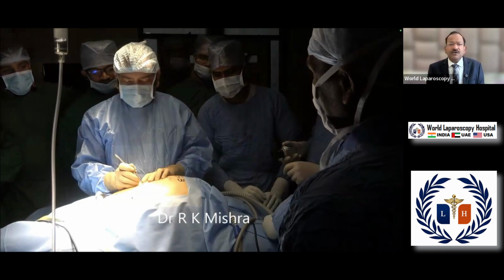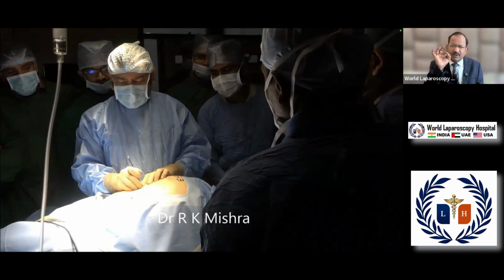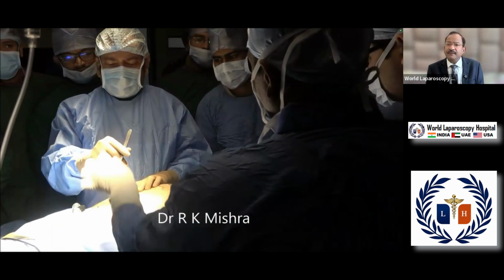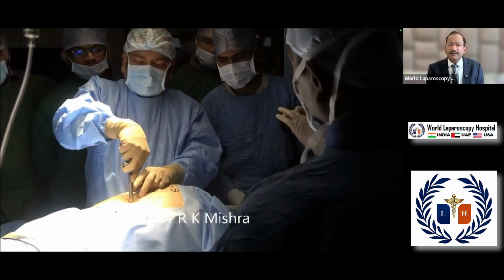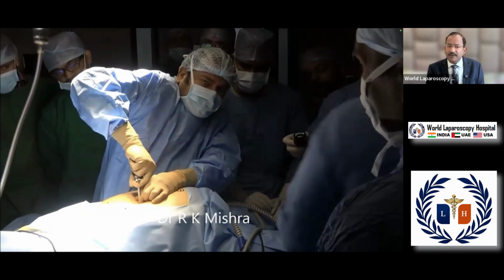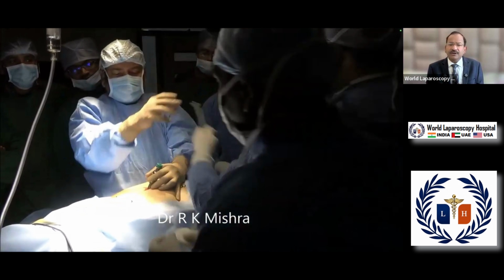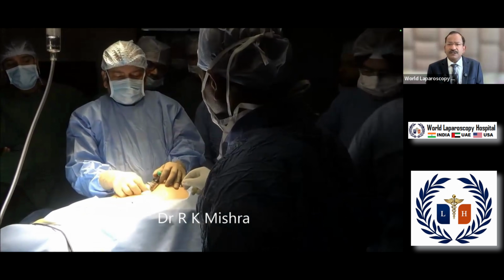And now this is the trocar. The trocar is supraumbilical, and that is why we give only a 2 millimeter stab wound. Gas will not leak from the Veress needle point. Remember, it is a needle prick, so it will not. The trocar is supraumbilical, and then the telescope will be supraumbilical, because it is a bariatric surgery. Then you will introduce the telescope, and then under vision you will put the other ports.